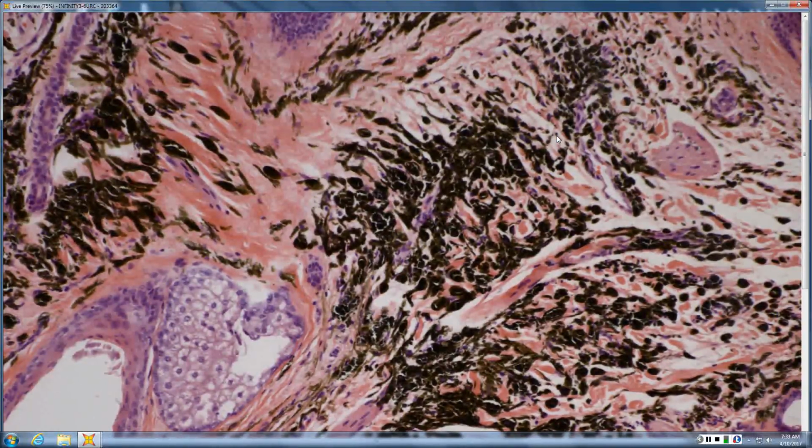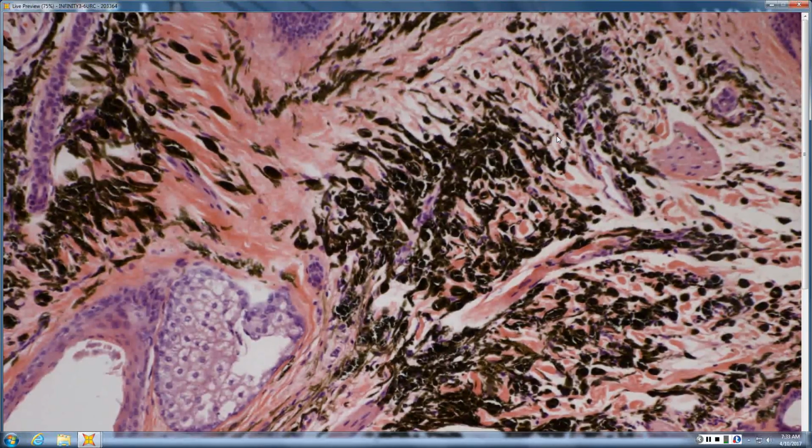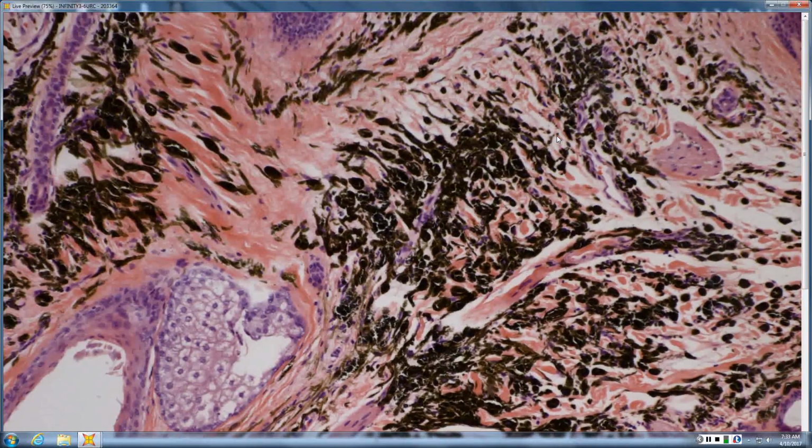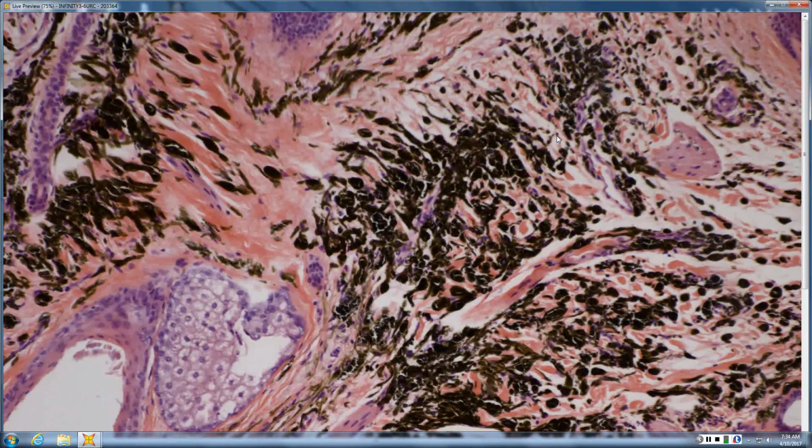So for any of the fellows, if you had only one stain to pick, GNAQ would probably be your background, but then BAP1. It's usually BAP1 on top of GNAQ for these. So if you don't have either of those, Ki-67 looking for an elevated proliferative fraction would probably be good. But this is one where right now at some centers you have something that looks kind of like a blue nevus but doesn't have its own stroma. They're getting a BAP1. If BAP1 is lost, that's potentially bad news, because that's what uveal melanoma in the iris and uveal-like melanoma in skin look like.